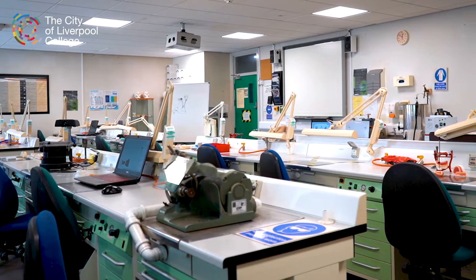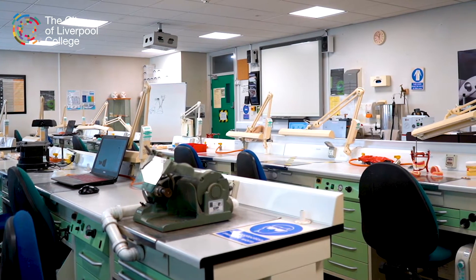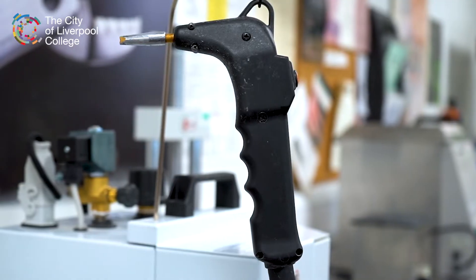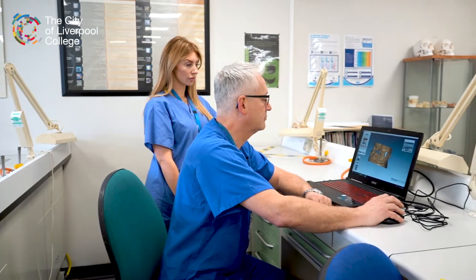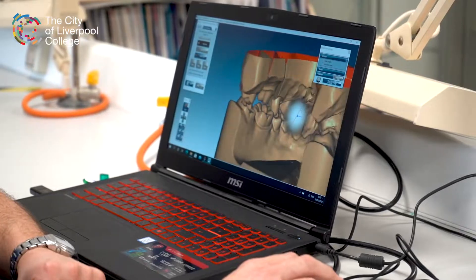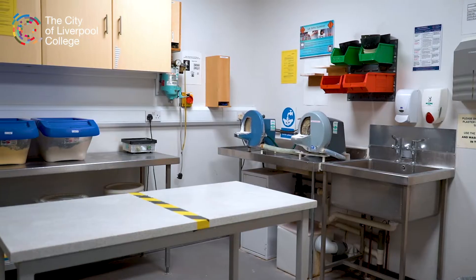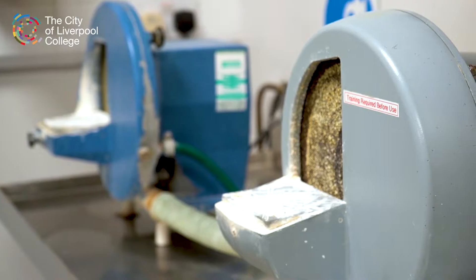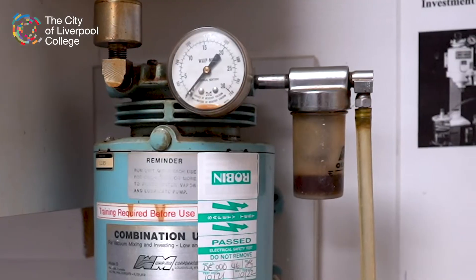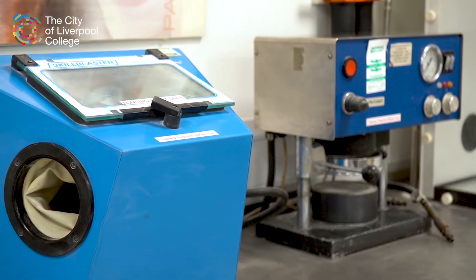We have all the equipment that you'd expect to find in most commercial dental laboratories. We've recently invested in CAD-CAM software, so we're using Cerec Mind on the Exocad system, and we're just awaiting delivery of 3D printers — Formlabs Form 3Bs. We're looking forward to integrating those into the course in the future.